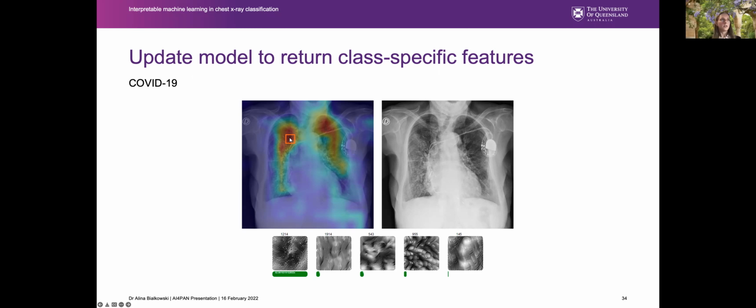I think that's a great idea. In my past work, I've done a lot of that. It falls in the space of perturbation interpretability methods. Basically, you'd have to corrupt that part of the image which it thinks is important, so you can remove that information and see how it predicts without it. In fact, you can do that completely without GradCam as well and get its own kind of visualization. If you literally just blank out each part of the image and then see how it affects the prediction, we can identify regions that are important. And so you could do similarly where you remove those parts and see the importance.